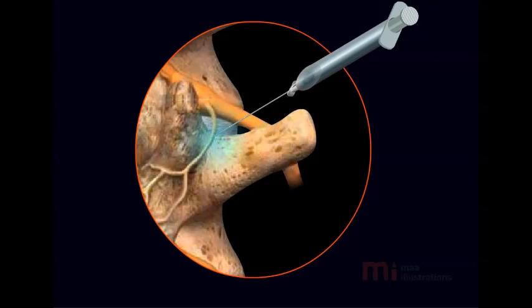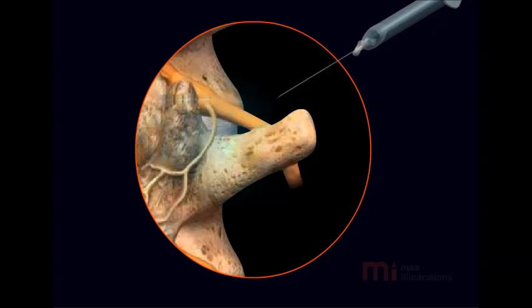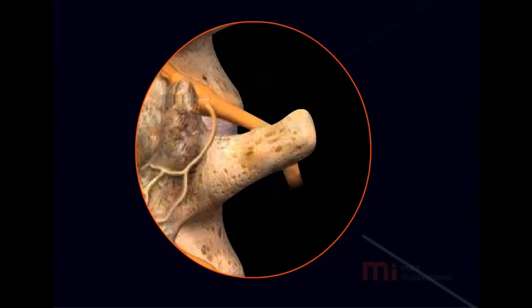Dr. Krishna will initially numb the skin and deeper tissues with a numbing medicine. He will then use a special X-ray machine to guide the Radio Frequency Needle accurately near the irritated medial branch nerve.